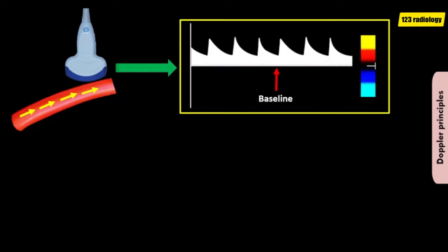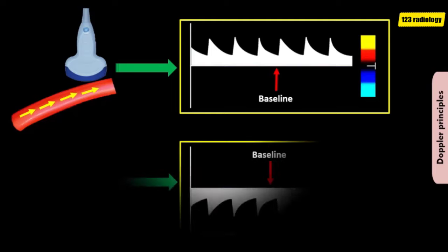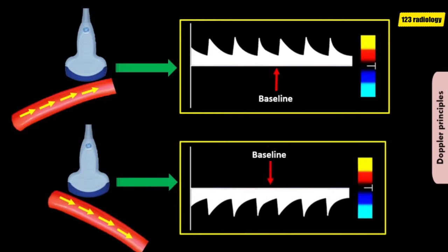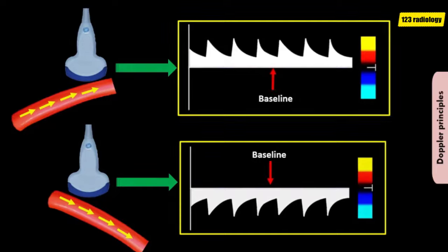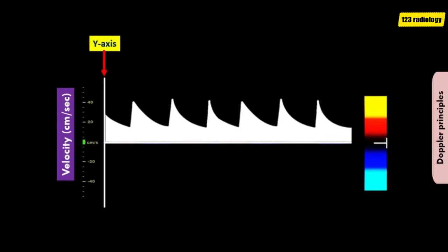If the blood flow direction is towards the transducer, the waveform is represented above the baseline. If the blood flow direction is away from the transducer, the waveform is represented below the baseline. On the y-axis, as you can see on this image, there is the velocity in centimeters per second.